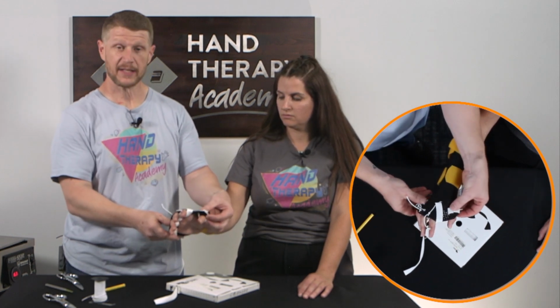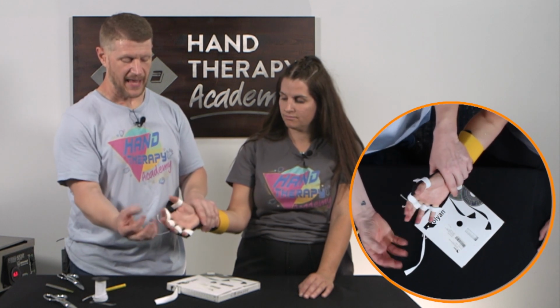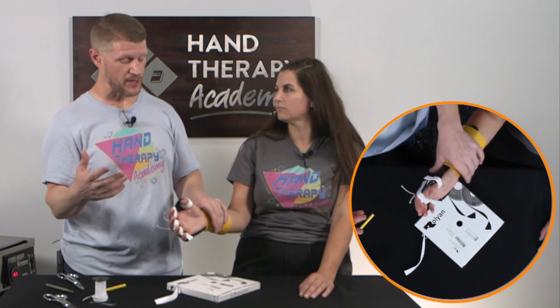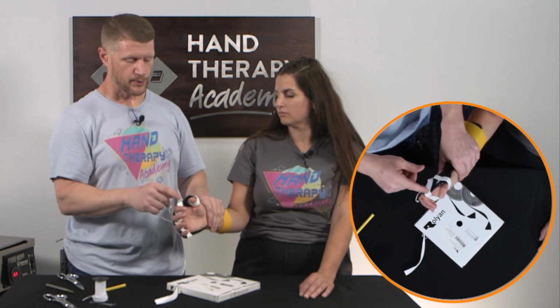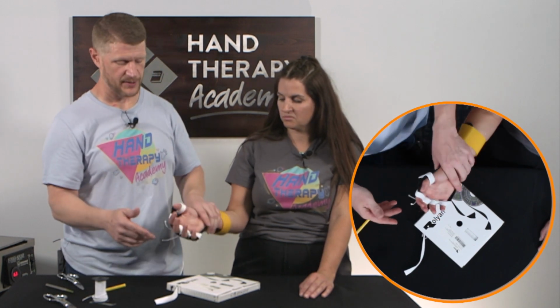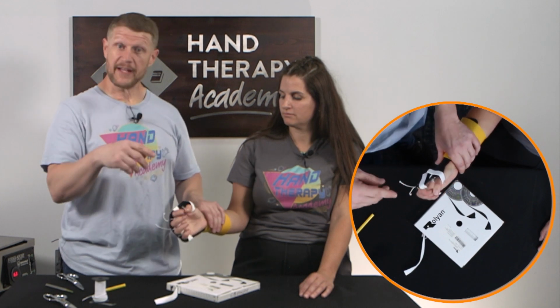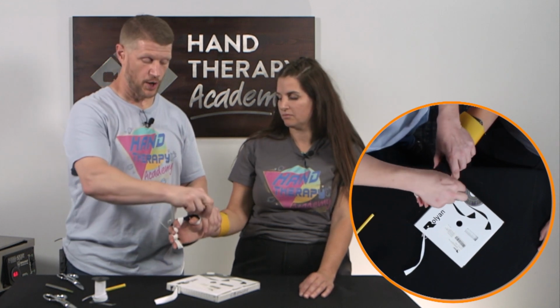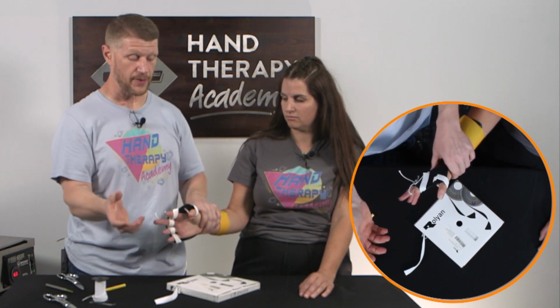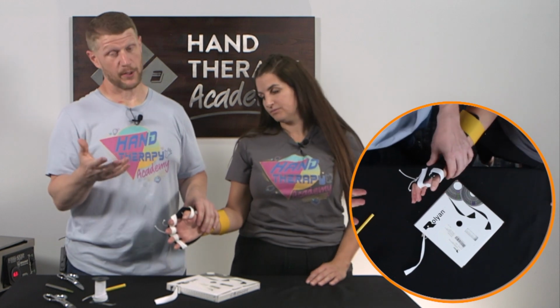And you can trim that to length when you need it, and that again allows that patient to pull the thumb down. And there's some natural flex to this. That's okay. If it's a big giant patient and they're pulling through too much, you can add another piece down the back side here and adhere that before you put the Velcro stickies on, but that gives her the ability to flex down. Early on, if they're a little weaker, you take some tension off of this, and it gives them more mobility of that thumb while still pulling them back up. As they get better, you can add some tension until they don't need it anymore.